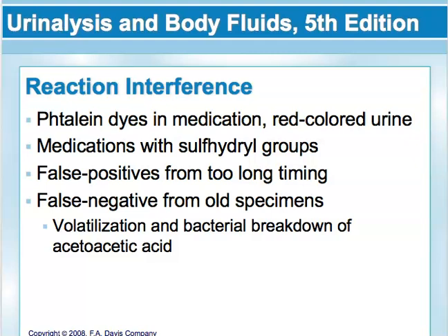And then some of your reaction interferences: certain dyes and medications or red colored urines, and medications containing sulfhydryl groups. Reactions with interfering substances will fade after standing, while color development from acetoacetic acid increases in intensity, but it could result in false positive reactions if the strips are allowed to sit for too long before being read. And then false negative results can be due to the volatilization of acetone and the breakdown of acetoacetic acid by bacteria, which could happen with improperly preserved specimens.